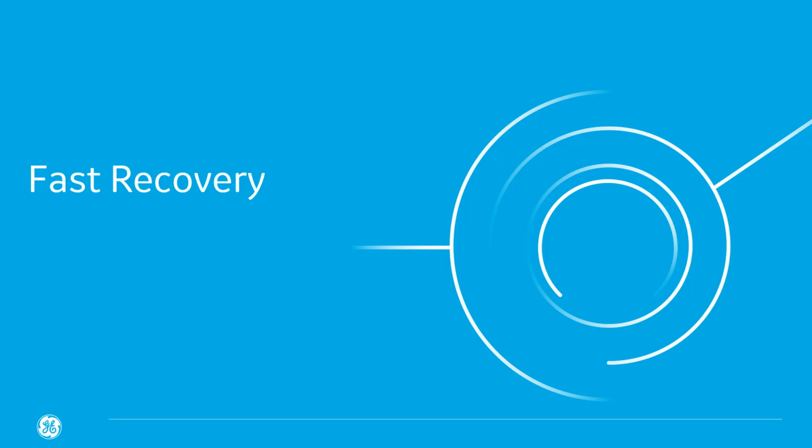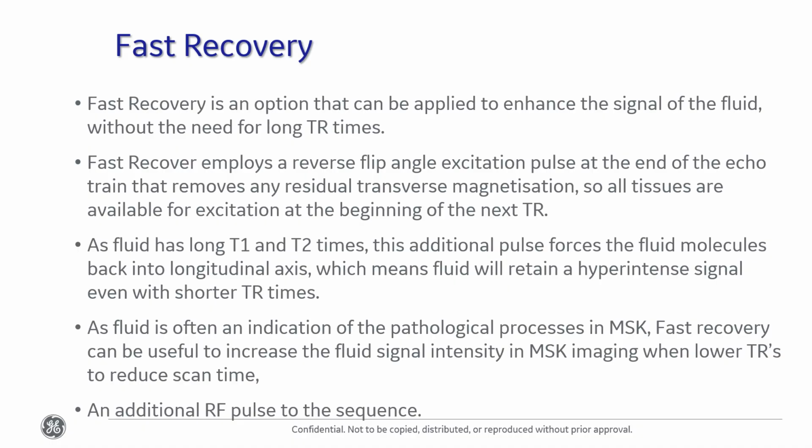So this leads into a discussion about fast recovery. So what is fast recovery? Fast recovery is a user-defined option that can be applied to ensure that we collect all of the available water molecules without the need for long TR times. So don't forget, if you're using a TR under about 3,500 milliseconds, there might not be sufficient time for all of the available water molecules to relax back to B0 ready for the next excitation.